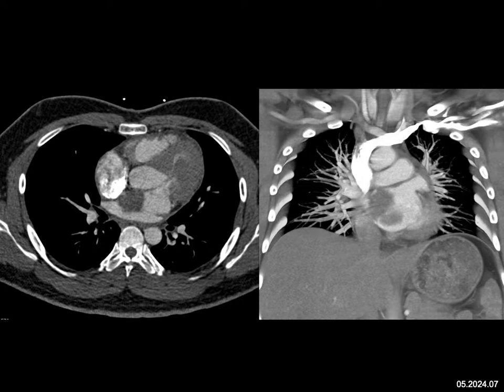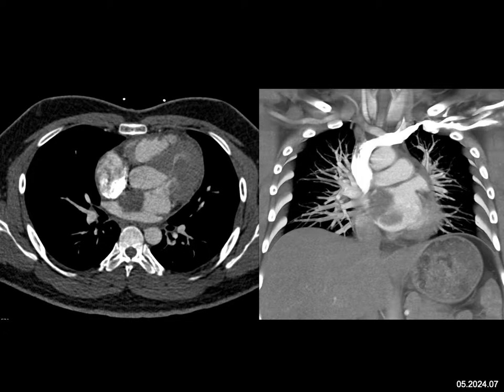Lymphoma typically involves the pericardium and can involve the chambers of the heart by direct extension and infiltration, which you don't see here. This is surely not simply a flow-related artifact. This is a very nice example of an atrial myxoma. Atrial myxomas can calcify, and at times it can be a real challenge differentiating an atrial myxoma from a thrombus.